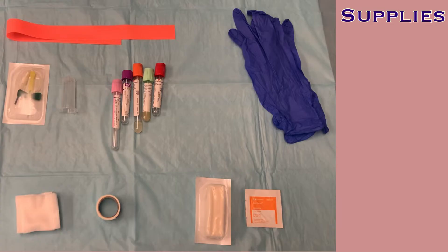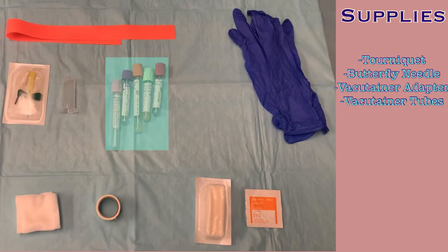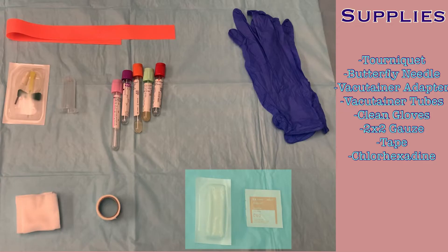Before you begin, you'll need to gather some supplies from the pod room. You will need a tourniquet, a butterfly needle, a vacutainer adapter, the vacutainer tube needed for the required labs, clean gloves, 2x2 gauze, tape, and a chlorhexidine applicator, or if that's not available, an alcohol prep wipe.